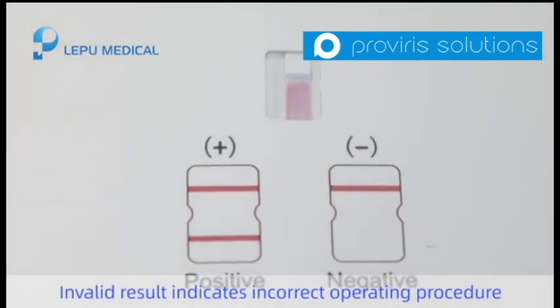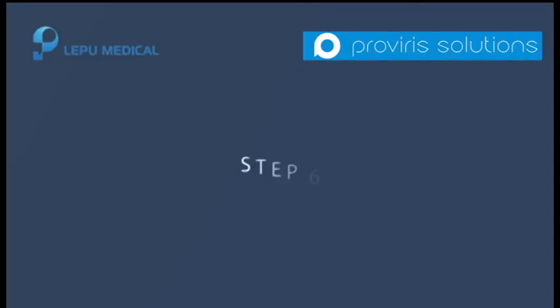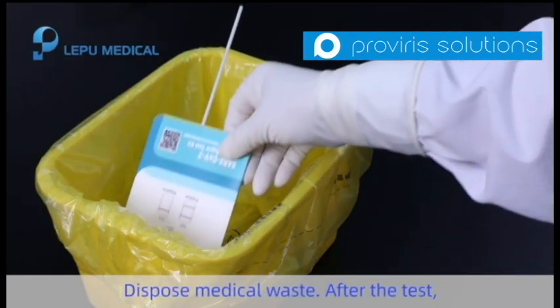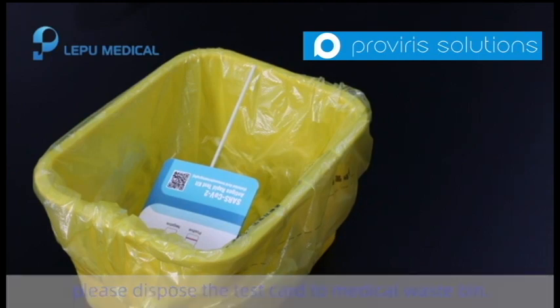Invalid results indicate incorrect operating procedure or the test card has deteriorated. Please try again. After the test, please dispose of the test card in a medical waste bin.